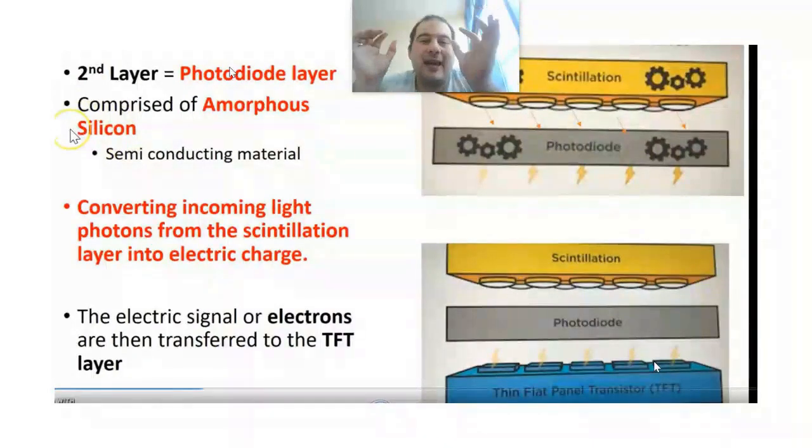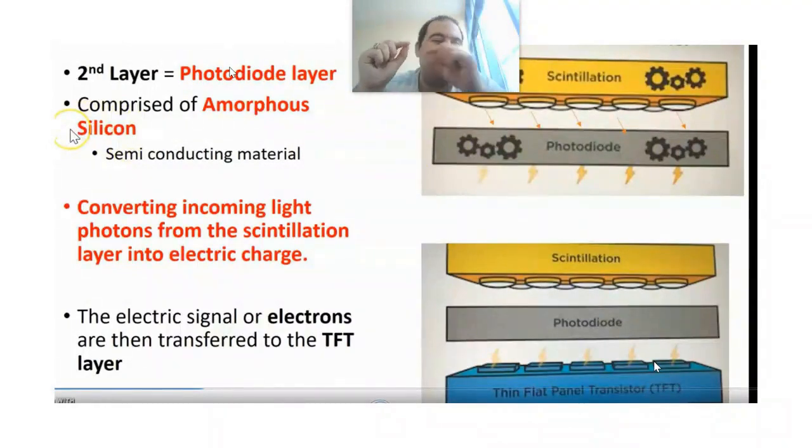You have every point on the photodiode below, and in front of it, there is a pixel that receives the electronic signal directly. This prevents the idea of signal diffusion, enhances the signal, and allows you to localize the signal from one place to another, which improves the performance. That's why, when they moved to the topic of direct radiography, they kept the TFT with us. However, the charge coupled device will not be mentioned much in the application.